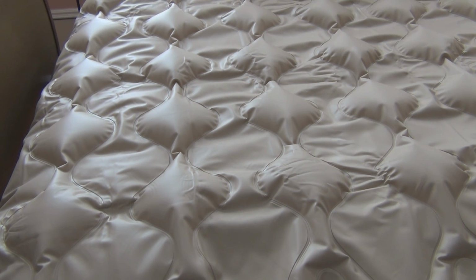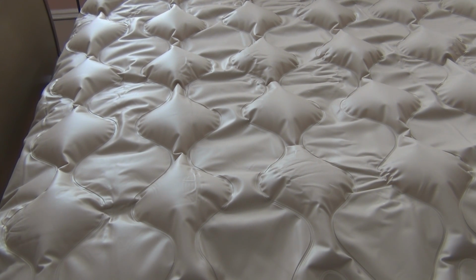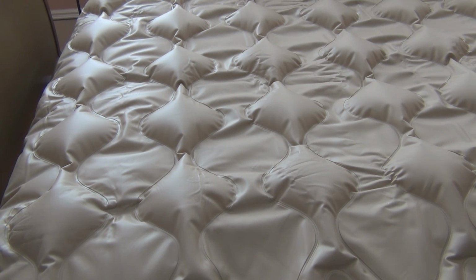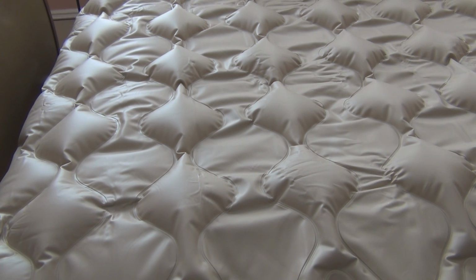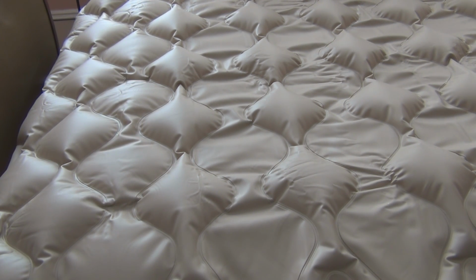So this alternating pressure pad was $27 and change, and again, that's something that should be covered by insurance, but in my particular case, they sort of dropped the ball, and although eventually I'm going to get it, it's good to be proactive, and I've already waited too long here. If you take care of someone, if you're a caregiver, and the individual spends any considerable amount of time in bed, it's really necessary to have one of these, because you can have very severe complications from bed sores or ulcers that can develop, especially with people with diabetes. It can become very serious very quickly, and for $27 to prevent that, prevent an emergency room trip and extended hospital stay or nursing care, it's definitely worth it.